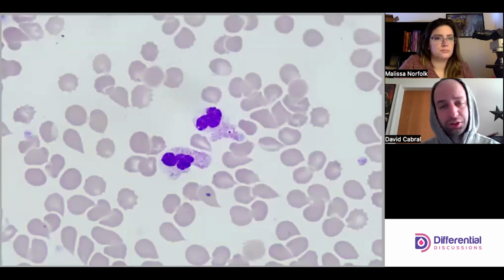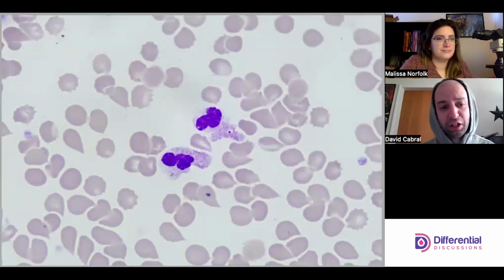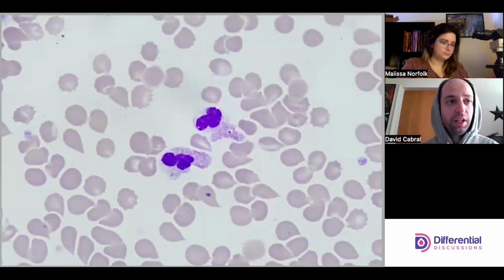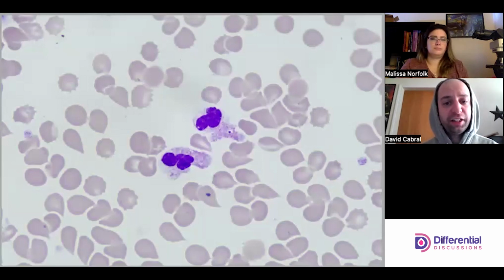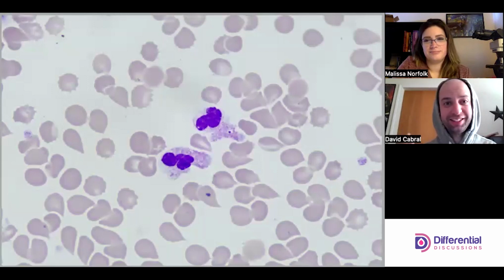And there are also serologic tests. Serologic tests are good, a little bit cheaper than PCR, but they take some time to develop, right? You need the full immune response to go through its paces. Alternatively, you can do peripheral blood evaluations. Finding it on Wright stain is quite difficult. We happen to have the mother lode here. This is one of the best slides I've ever seen for an anaplasma, so we're really excited to have it here.